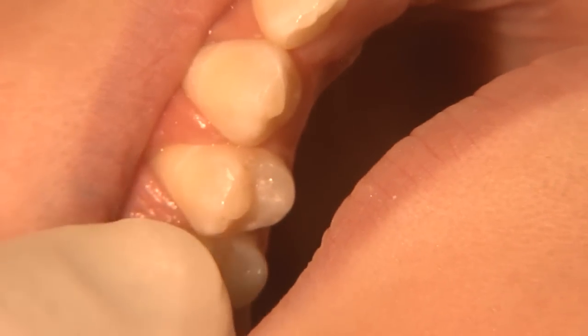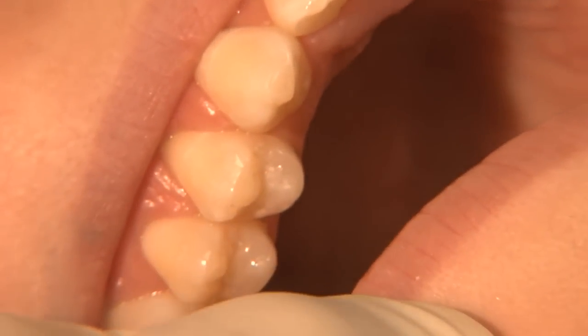We are going to perform a dental sealant on this patient on the second bicuspid. Ideally, the tooth is first pumiced to clean off any debris, and then an acid etch is placed to roughen up the surface. Let me have the acid etch, please.